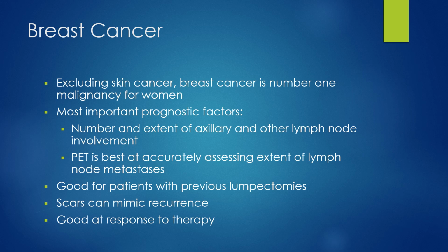So you'll see breast cancer patients a lot in nuclear medicine, but the FDG studies are pretty commonly seen. They get repeat FDG studies when they're initially diagnosed, periodically through their treatment, and then later as follow-ups. And what they're looking for with the FDG studies, of course, you can see metastases anywhere, but they're primarily looking for the lymph nodes.